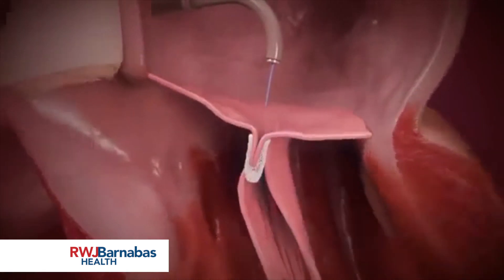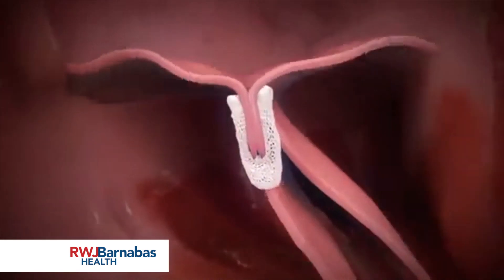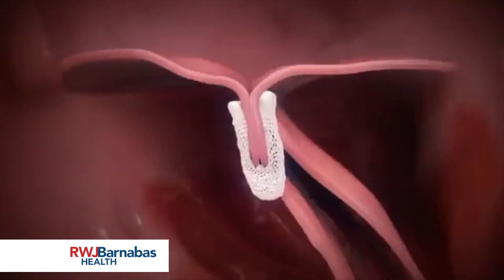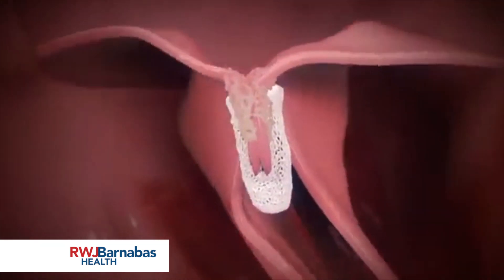Once achieved, the clip is released and the full system retracted. In most cases, the transeptal puncture reseals itself and tissue ingrowth between the clip arms increases, facilitated by the polyester clip covering, which promotes healing to create a fibrous tissue bridge between the leaflets.